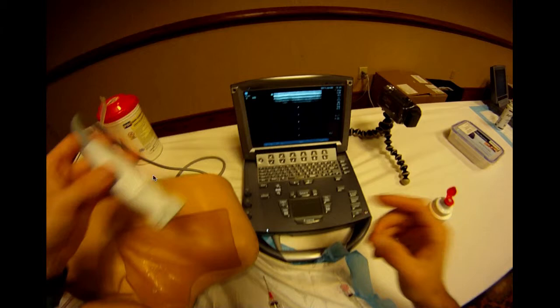When you look at most probes, there's a little nubbin on one side of the probe. And that nubbin often corresponds to that dot that we see usually on the left side of the screen. You want to make sure those are matched up, because if they're reversed, then you get a symmetric reversal of the image you're supposed to see. If you push the needle towards the left, you'll see it show up on the right, and it really doesn't help you guide the needle. In fact, it is misleading.